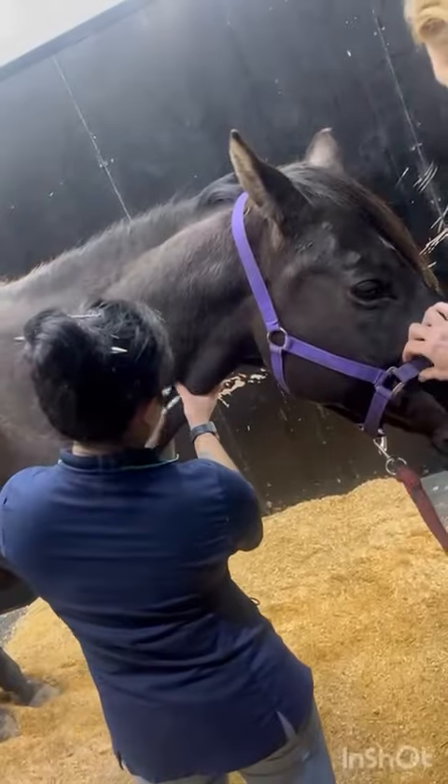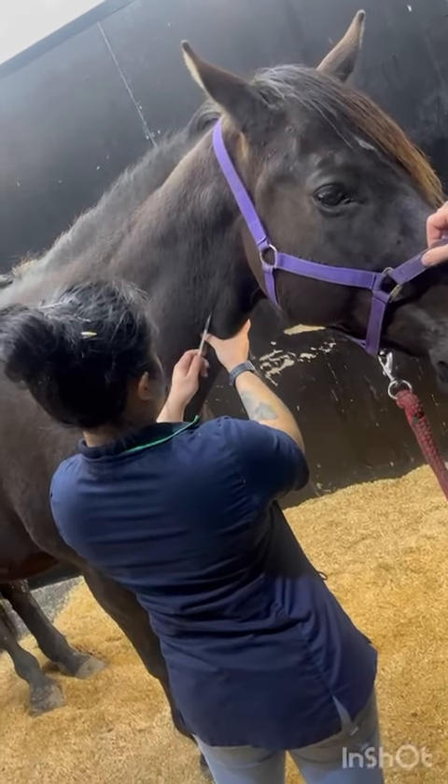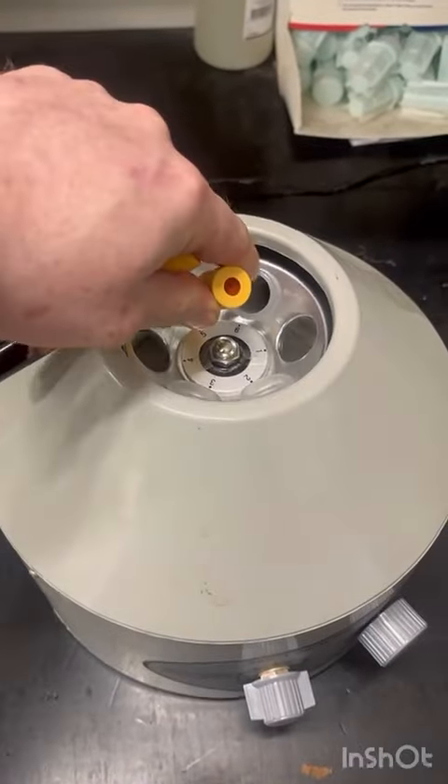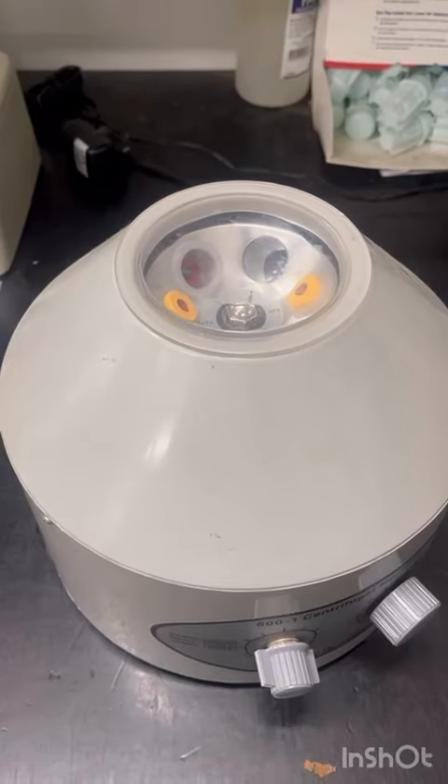So just showing you that process — we get a donor horse. First we need to check that the blood from our donor matches our patient. If they don't match, then we may get an immune reaction in our patient which could cause the blood to agglutinate and could cause the patient to die.